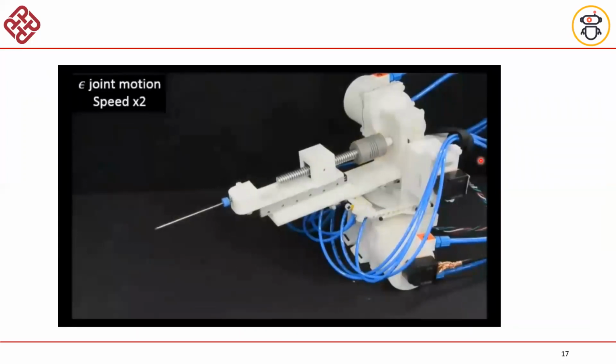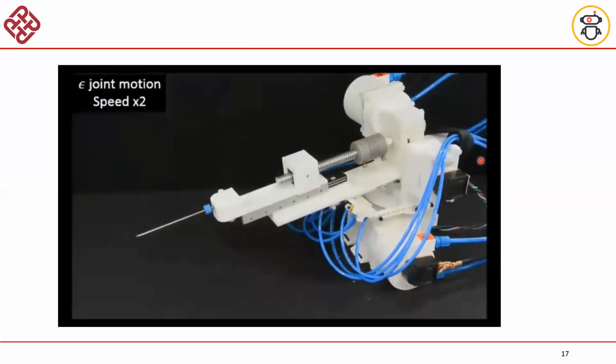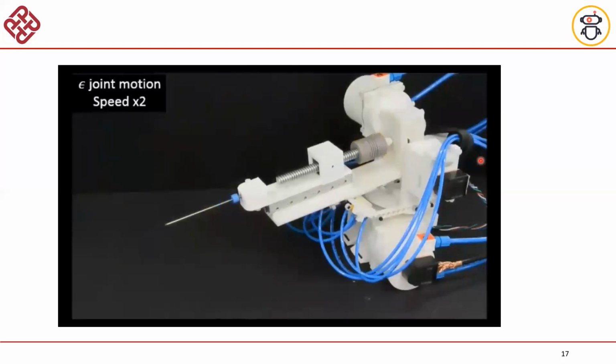However, as with any system, you have some disadvantages. One disadvantage I can point to is hysteresis, as I mentioned, which is quite significant in this system. Another is that the generated torque is not so much. You really need to use a high reduction ratio in your motor because it's not so strong in many ways.